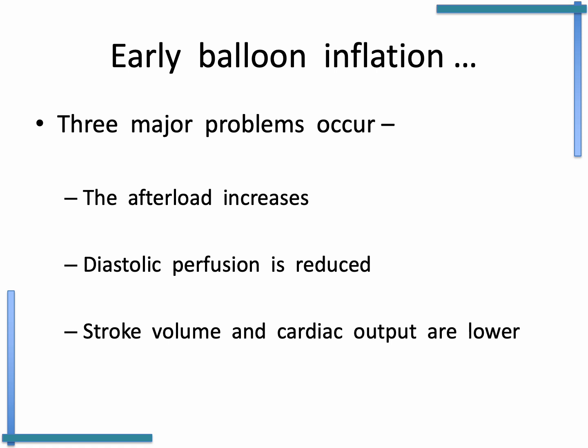And then last of all, the stroke volume and the cardiac output are lower. And in fact, once we've been through all of the 4 errors of timing, you'll come to realize that early balloon inflation is the most problematic and/or dangerous of all the mistimings of a balloon pump, and it's something that you want to watch out is not happening.